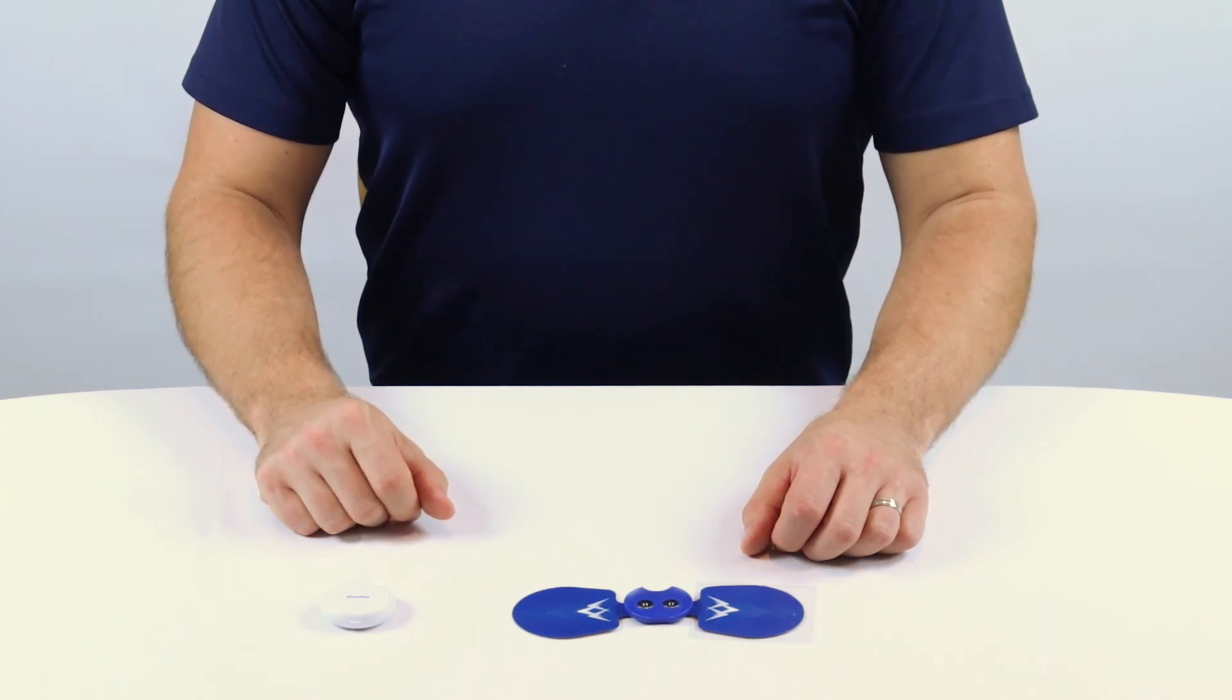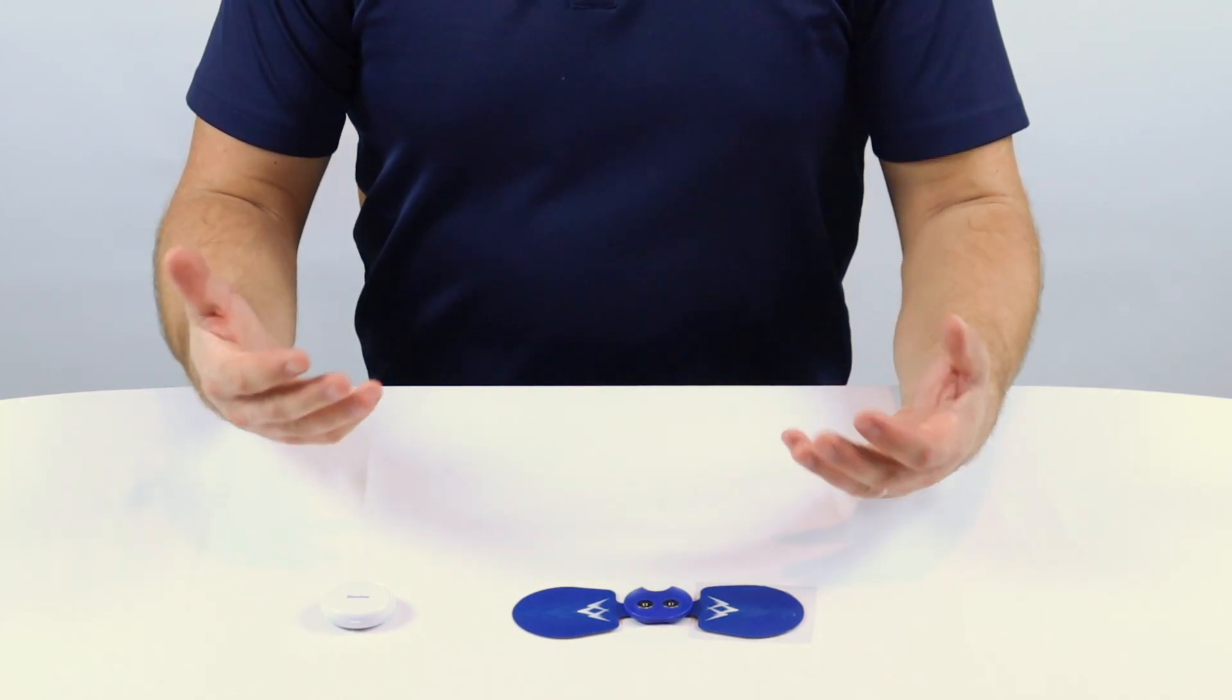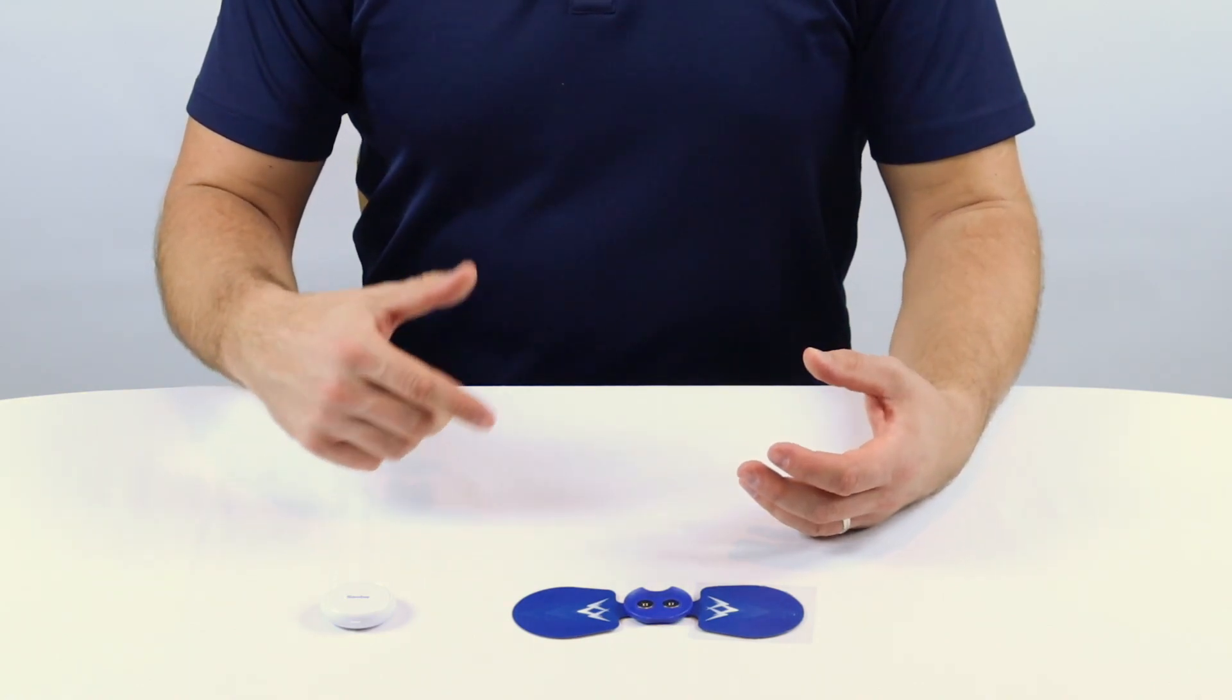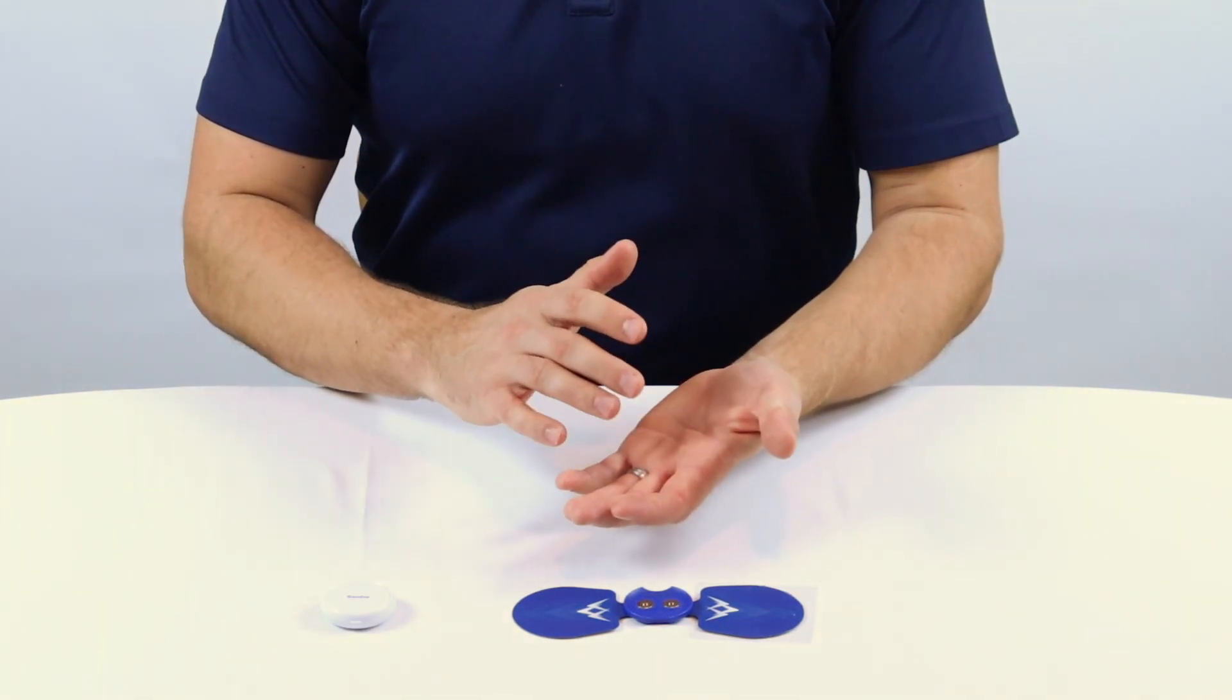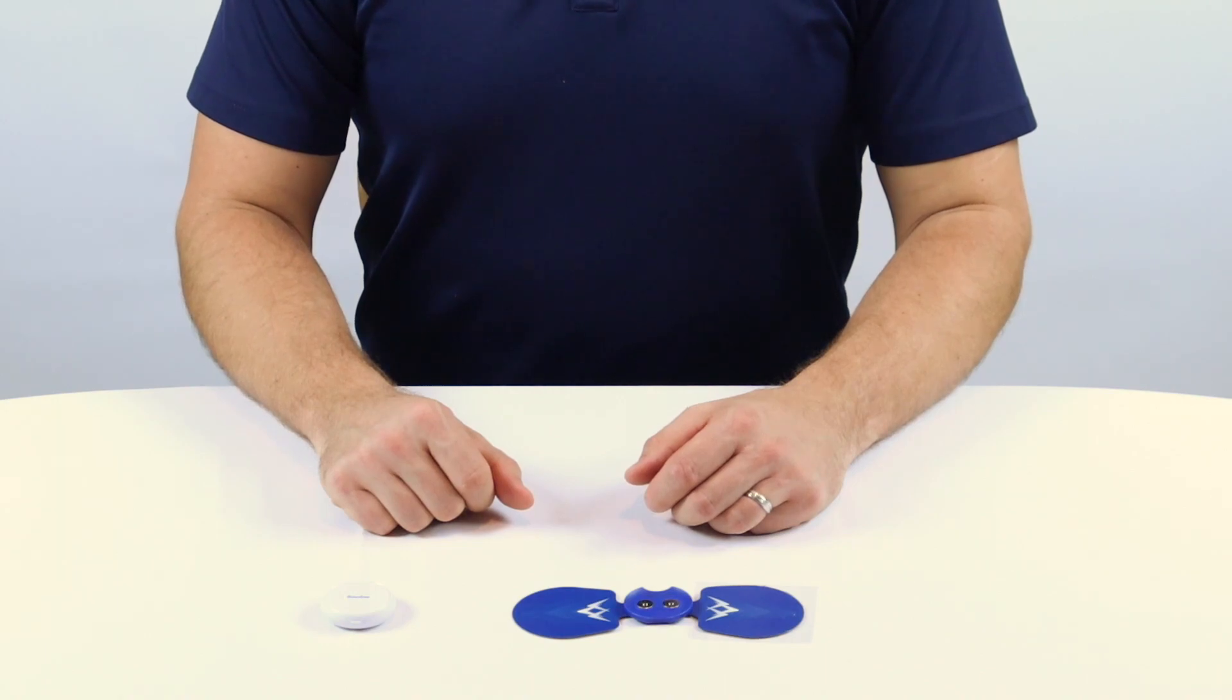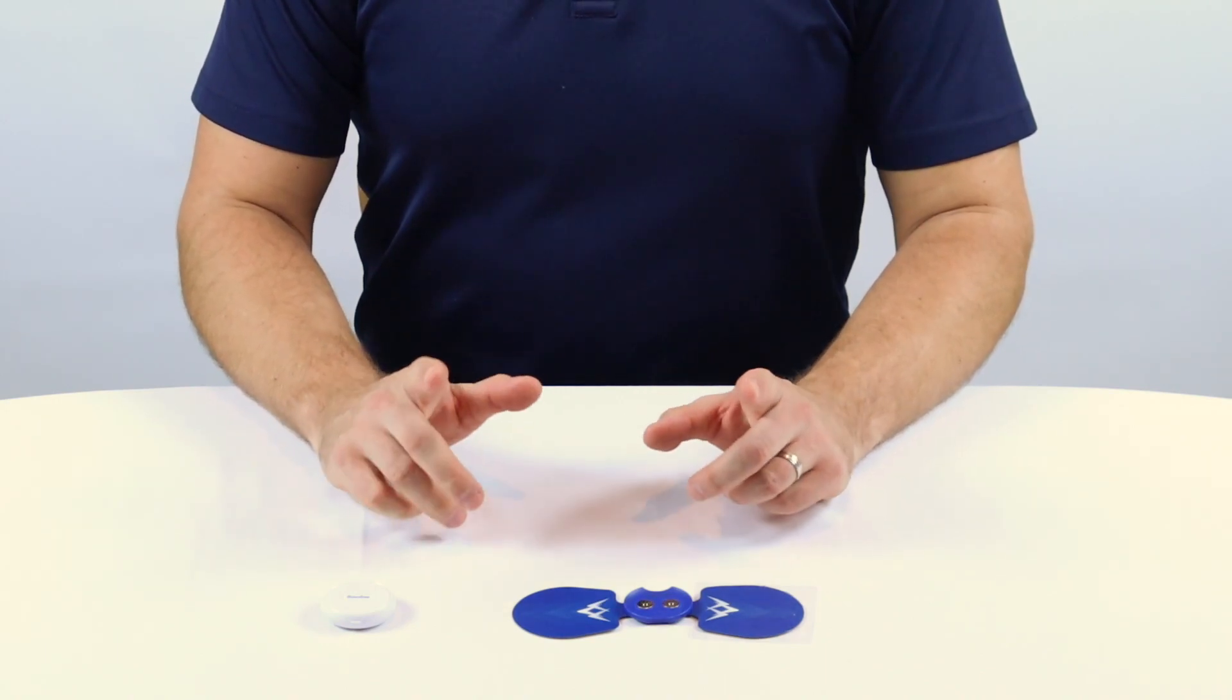Another commonly asked question about the Sabostim Go is, what is the best way to change the gel pads on the wings? It's important to change the gel pads because after a while, you'll notice that the gel pads will no longer be sticky, affecting the Sabostim Go's performance. Changing the gel pads is much easier than you might think.